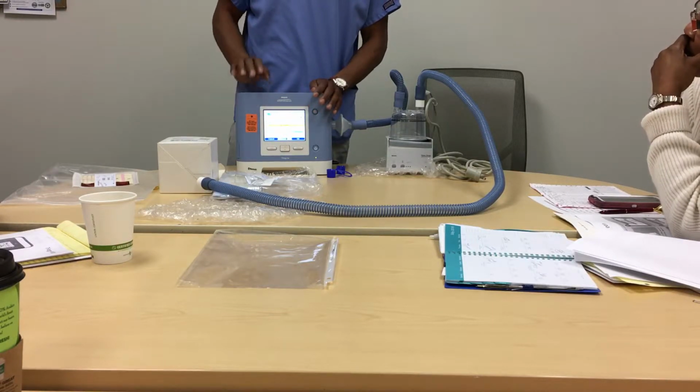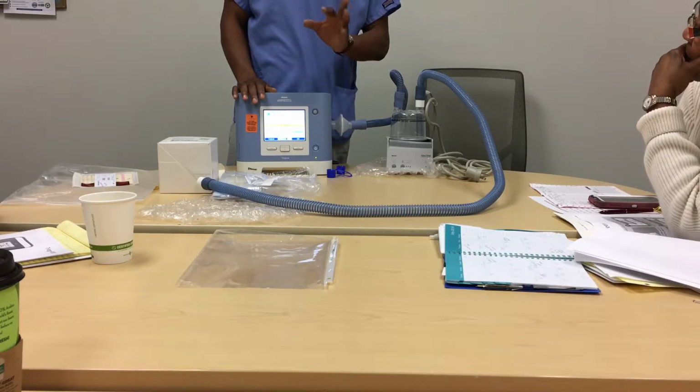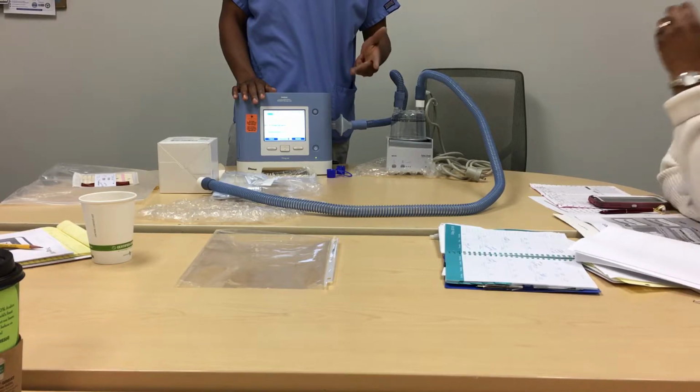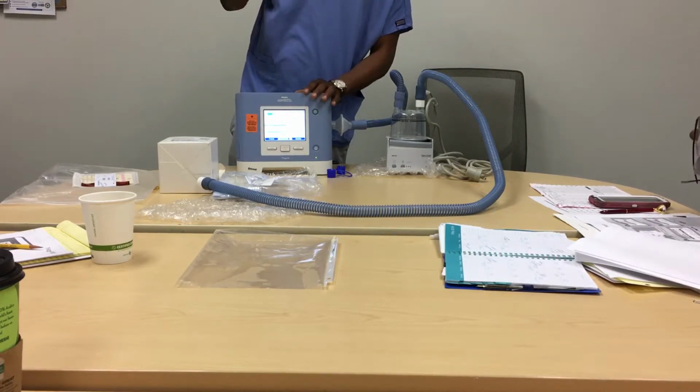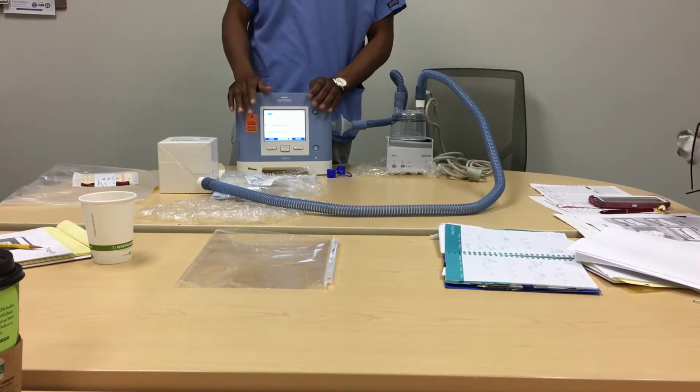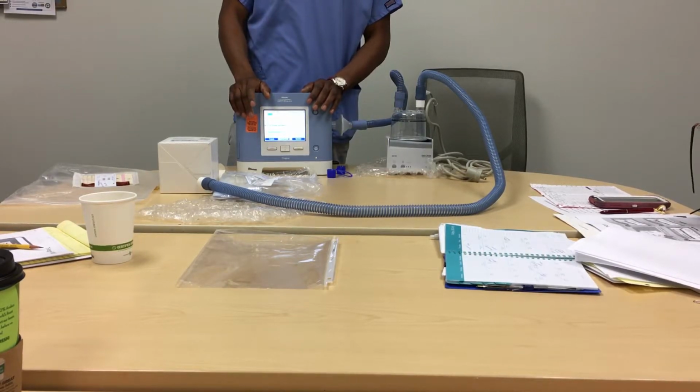Okay, so the questions that are tricky, what I've seen, they typically go on three modes: SIMV, volume or pressure control. With that, you could also add the AVAPS mode on it. All it does is it lets you get a set rate and a set volume. But typically, trick questions use three main modes.